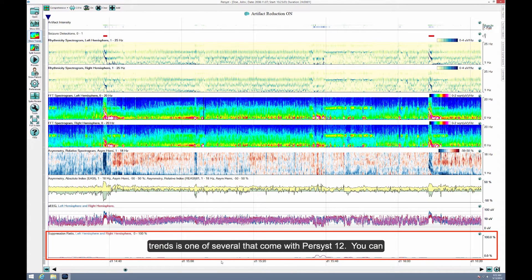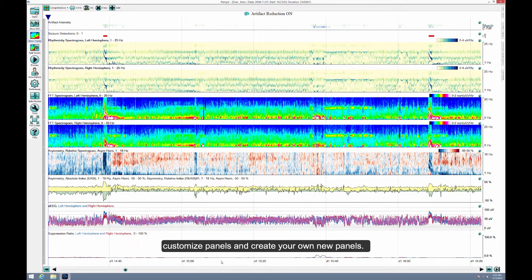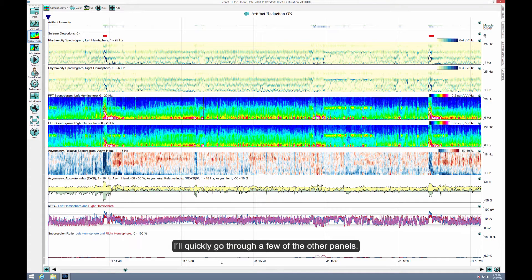This panel of trends is one of several that come with Persyst 12. You can customize panels and create your own new panels. I'll quickly go through a few of the other panels.